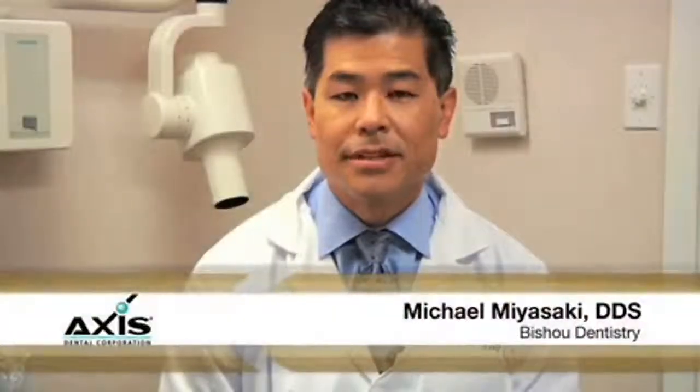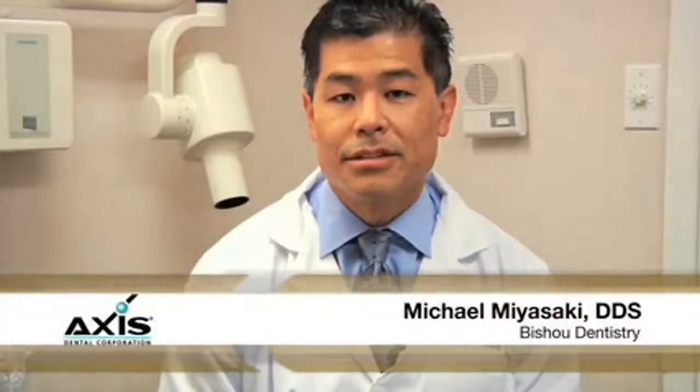Hi, I'm Dr. Michael Miyazaki from Las Vegas, Nevada. What we're here today to demonstrate is the axis burrs that we use post-cementation to adjust the bite on porcelain inlays, onlays, and crowns.